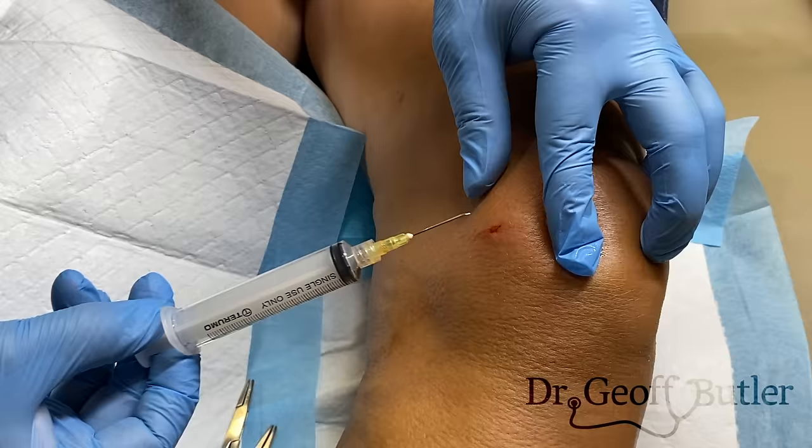Just a little bit of fluid but not too bad. I'm going to put a dressing on that, clean it up, and send that off for analysis.